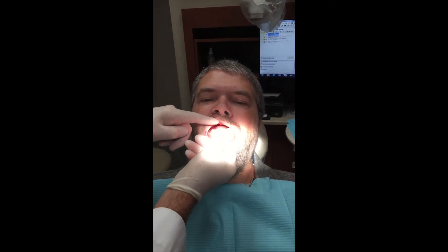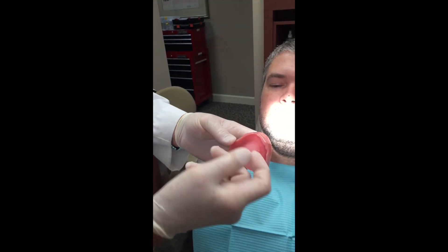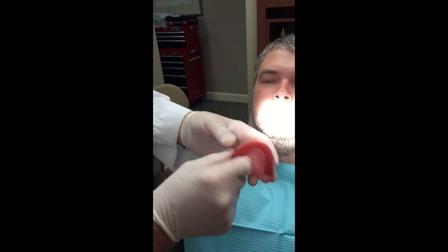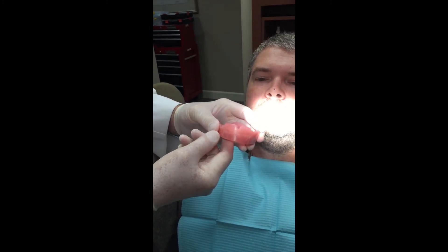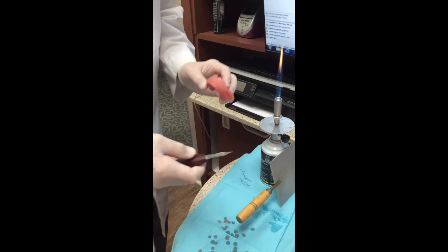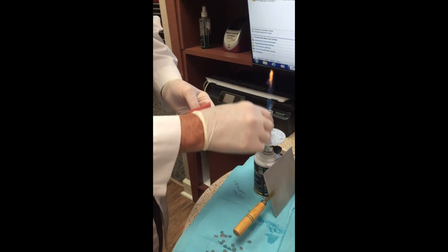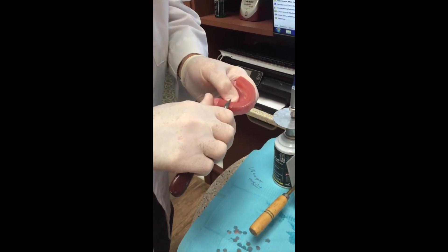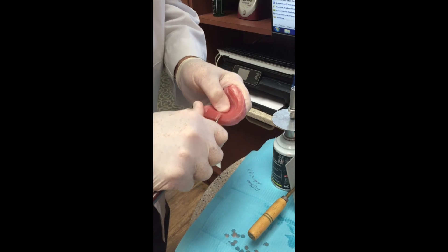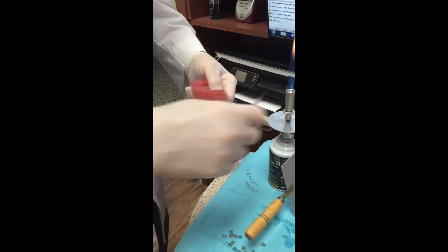A lot of wax rims will be a little loose because we do not use solid wax. We use a triad record base with wax rims and they have to be made to come off. Now you can kind of see my markings, and that's very important. After we've gotten the upper occlusal rim, we're going to use the Bard-Parker and cut some keyways that we use for mounting purposes and orientation — usually two keyways back at about the second bicuspid areas.